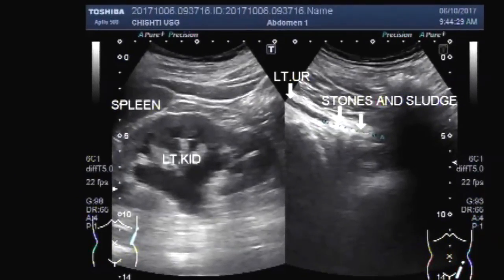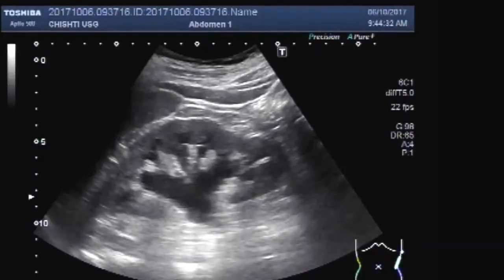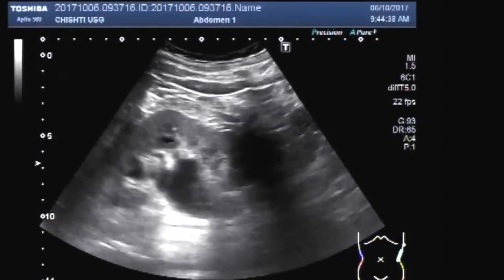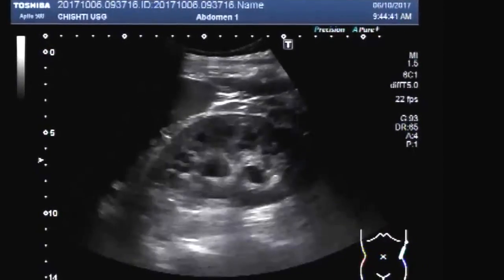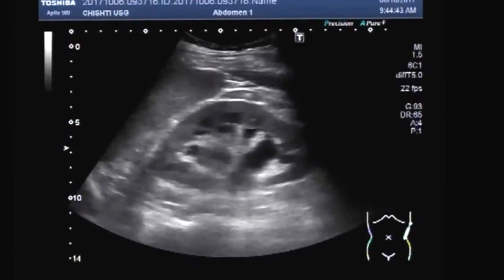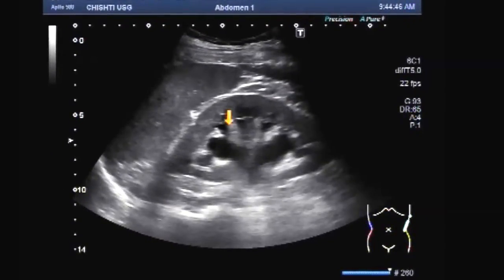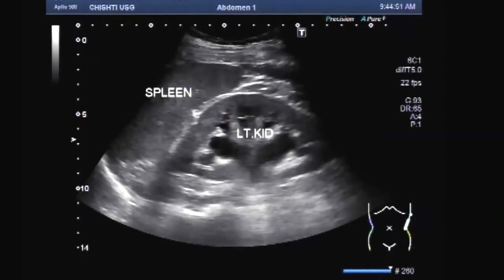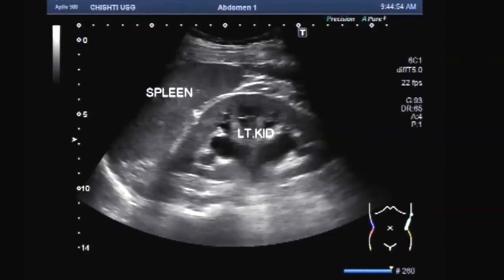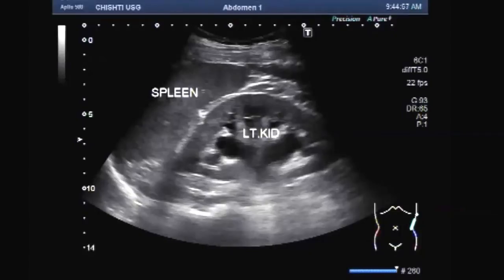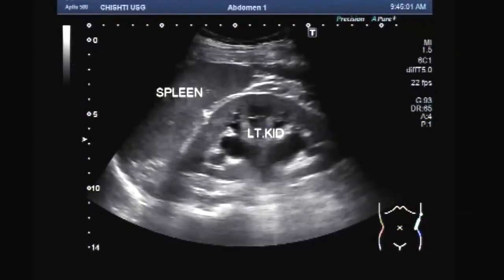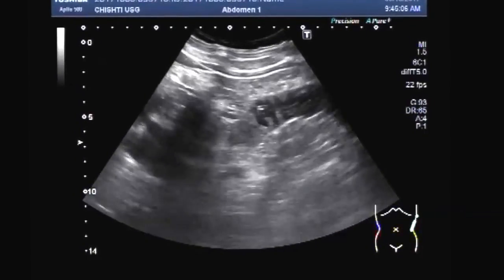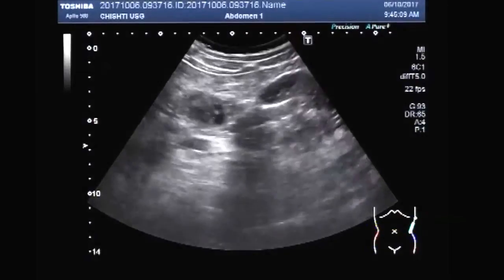Hello viewers, I hope you are fine. This is a case of stones and sludge in the ureter. You can see the left kidney on this plain scan. There is mild to moderate hydronephrosis of the left kidney. Now we will focus on the ureter — you can see the dilated left ureter.